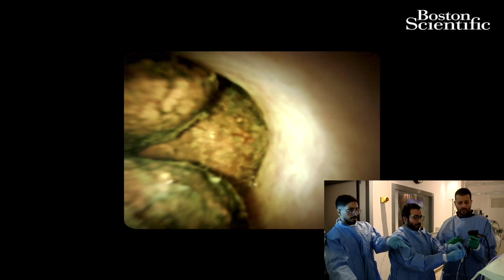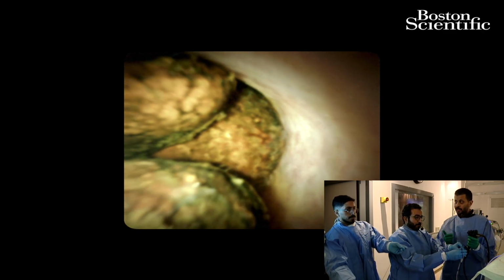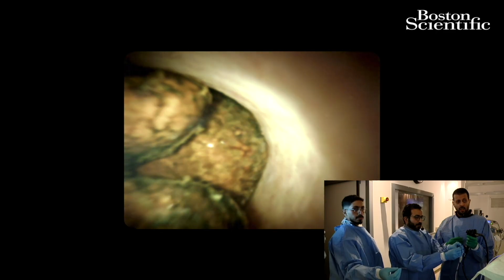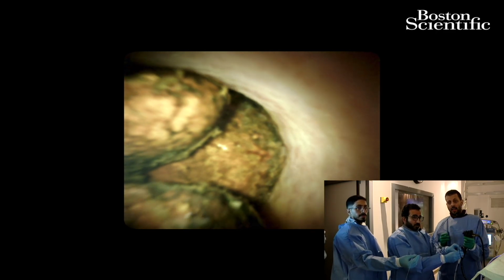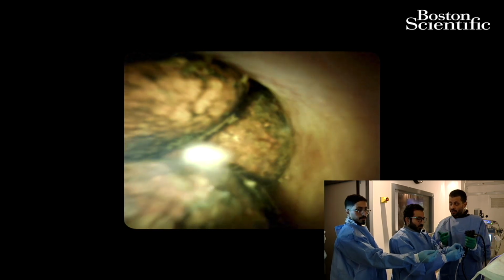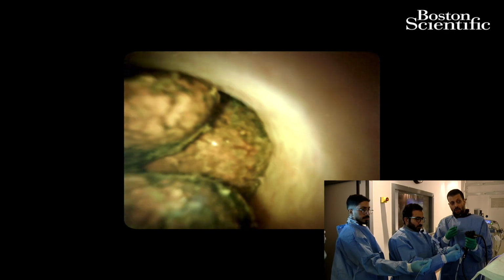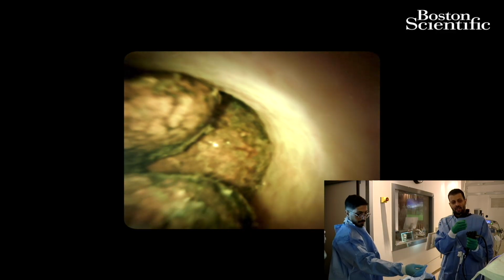So the issue always, as well, is when advancing EHL or laser, especially higher up in the common bile duct, approximately around the bifurcation, that there may be a little bit of resistance advancing the EHL catheter, and that is very common. And then you have two approaches. Either you try as much as possible to unlock all your wheels, get the catheter out, and then go back to where we are right now, because most of the time it is too good to be true to get there and get the EHL in smoothly.